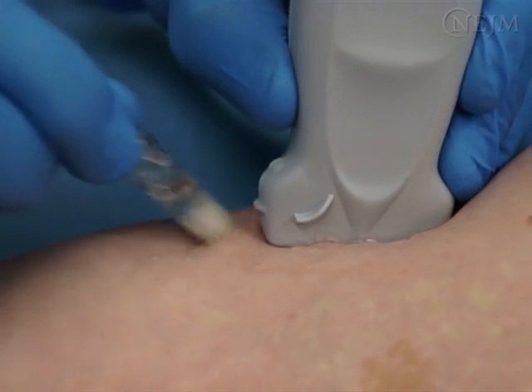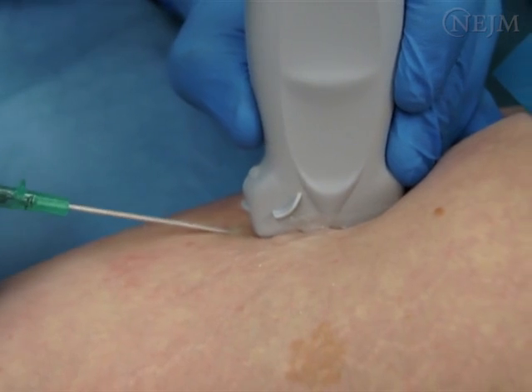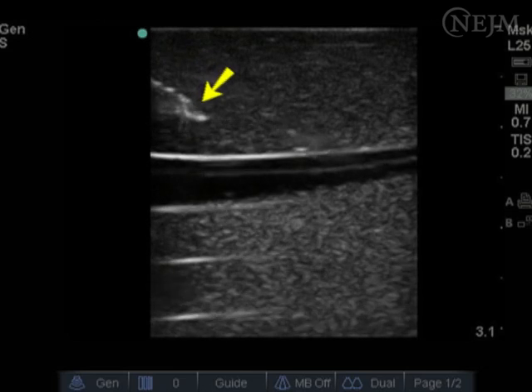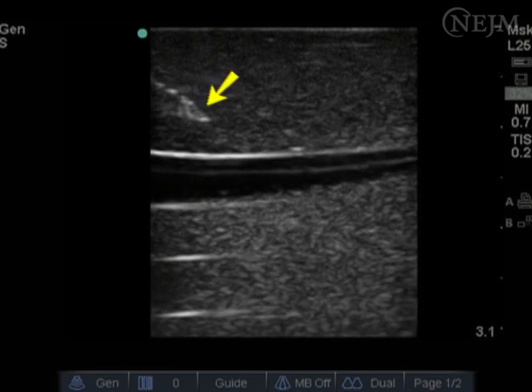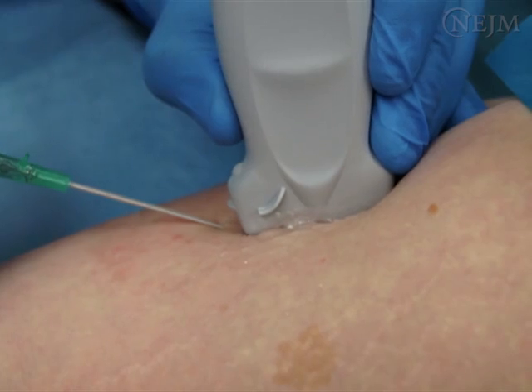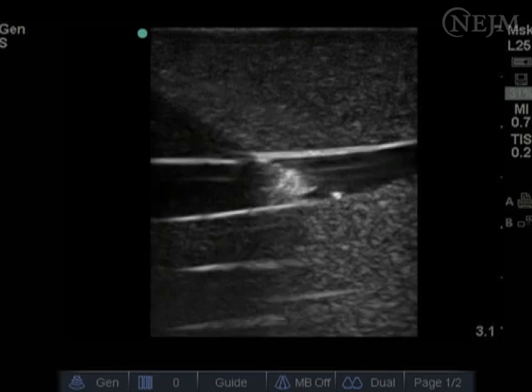Use an antiseptic swab. Carefully align the needle before insertion so that the trajectory will be precisely within the ultrasound plane. Puncture the skin just distal to the transducer. You should be able to clearly visualize the needle tip during the entire procedure, but this requires perfect alignment of the needle with the ultrasound plane. If you can't see the needle, it is lateral to the ultrasound plane. Back up and redirect the needle as necessary. Do not advance the needle unless you can see the tip.